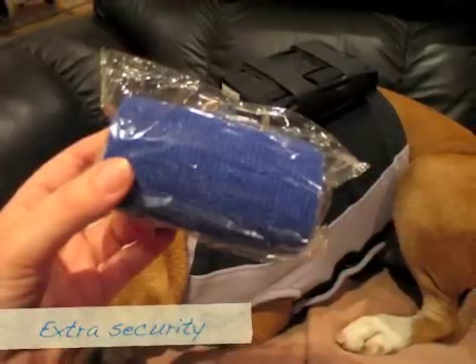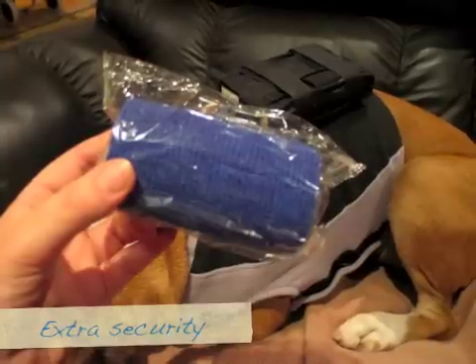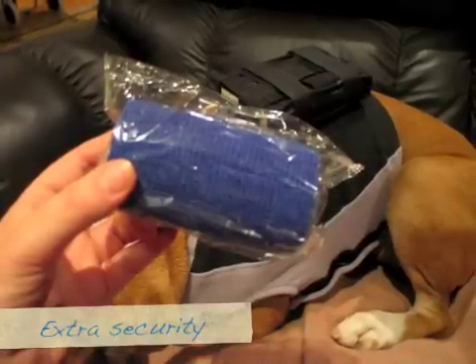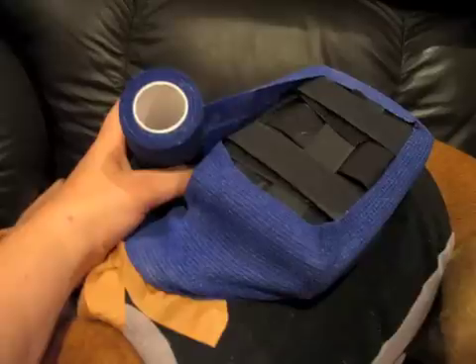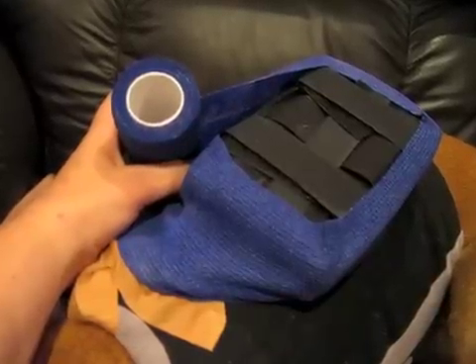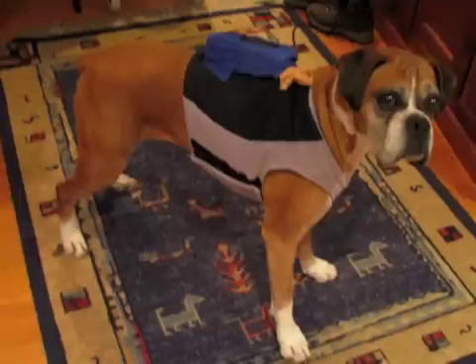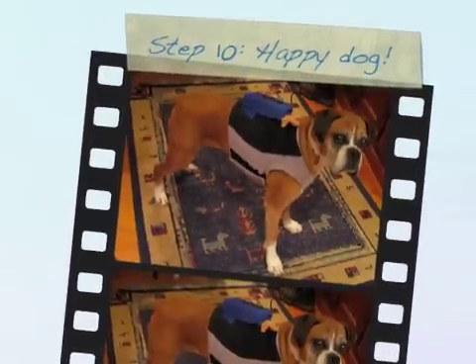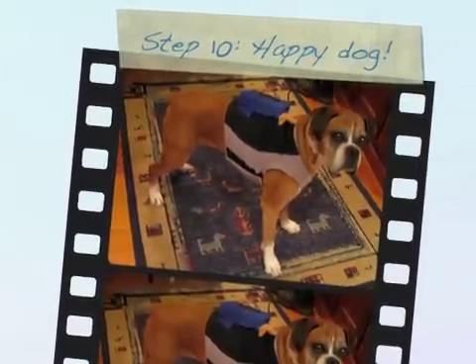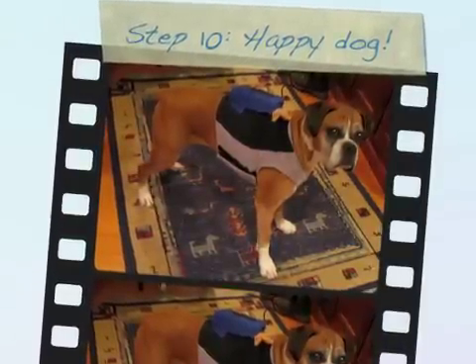For extra protection, I like to cover the exposed areas of the recorder with this stretchy, thin, self-adhesive bandage, sometimes known as vet wrap, and I'm just putting it around the machine so that everything's covered. I also put some sports tape over the exposed wires. This is hopefully the end result of a very happy and comfortable dog — and in 24 hours, you will have the recording finished.